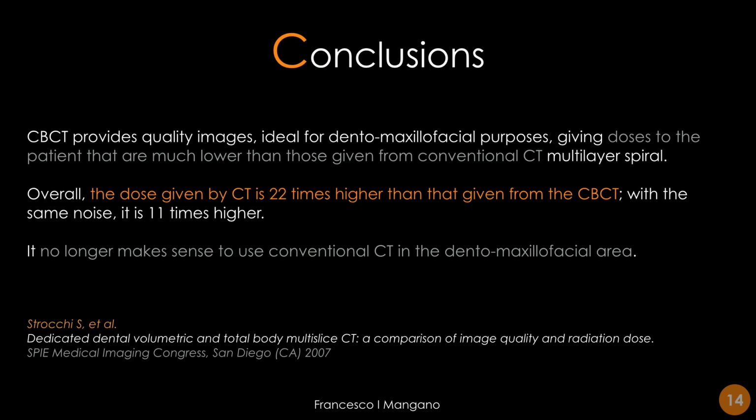The conclusions were very easy. Cone-beam computed tomography is capable of providing high-quality images that are perfect for dentomaxillofacial purposes, and considering that the radiation doses are much lower than those given by a medical CT, it is of course the ideal tool for dental and maxillofacial purposes in order to investigate the hard tissues of the oral cavity and also the maxillofacial district.